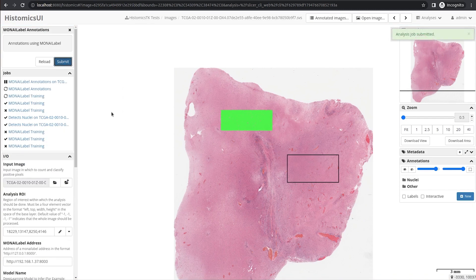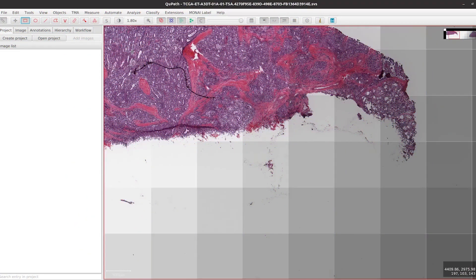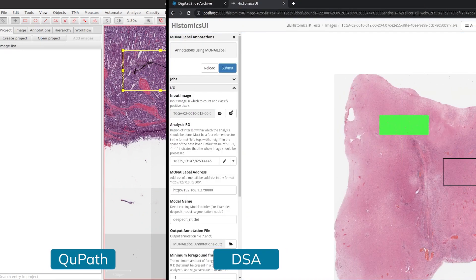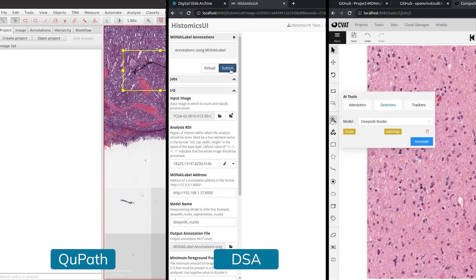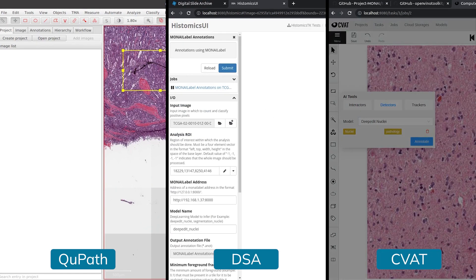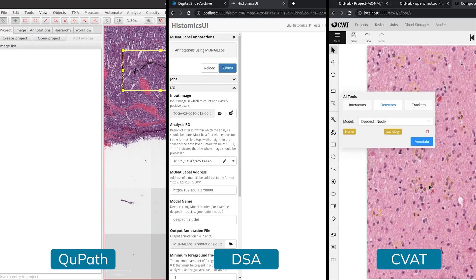MoniLabel now integrates three pathology viewers including QPath, Digital Slide Archive or DSA, and CVAT. You can choose your favorite viewer and quickly start labeling pathology images today.